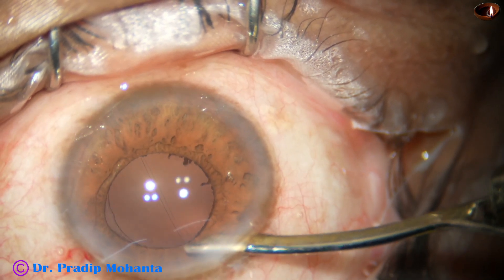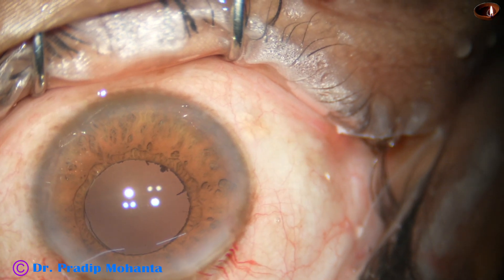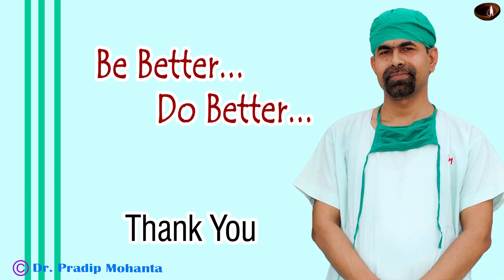This is the final lavage of the anterior chamber. The anterior chamber is nicely formed. Integrity of all the wounds is checked. A few drops of Moxifloxacin are applied over the ocular surface and the case is concluded.